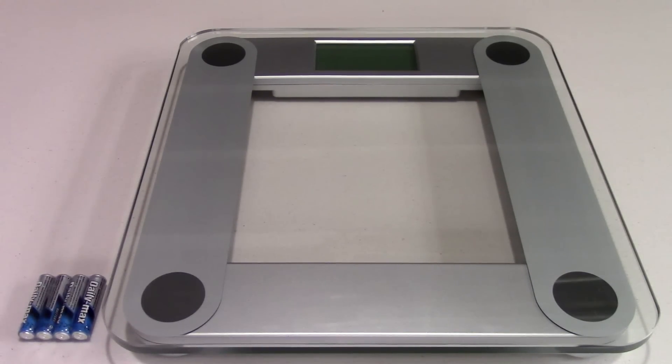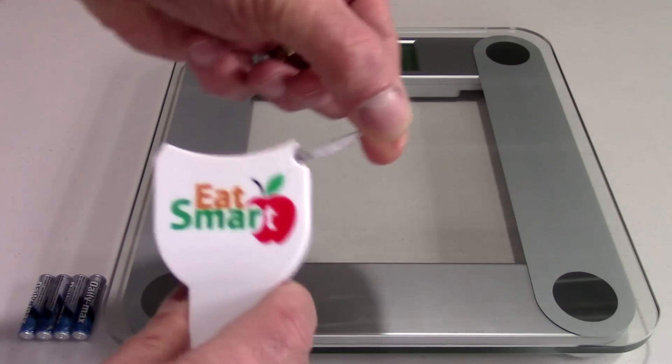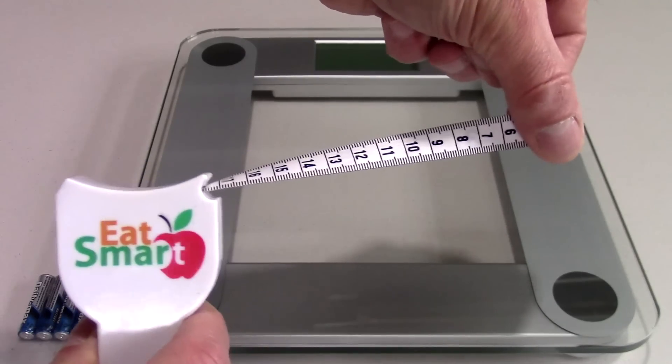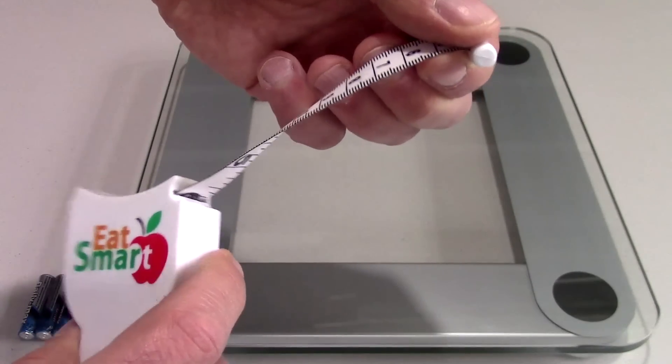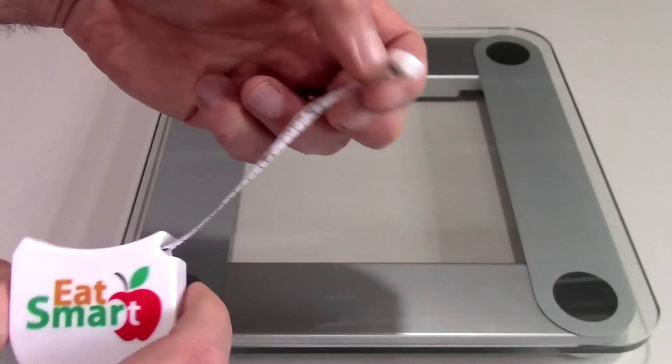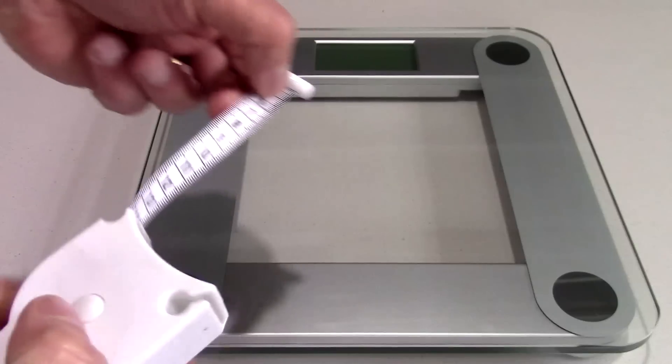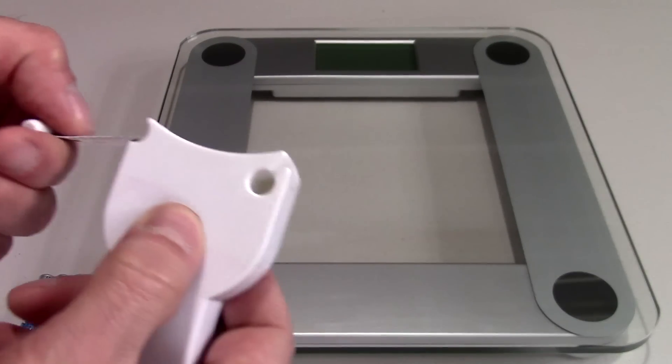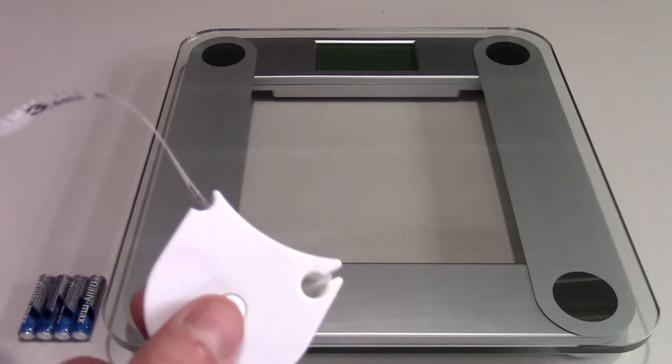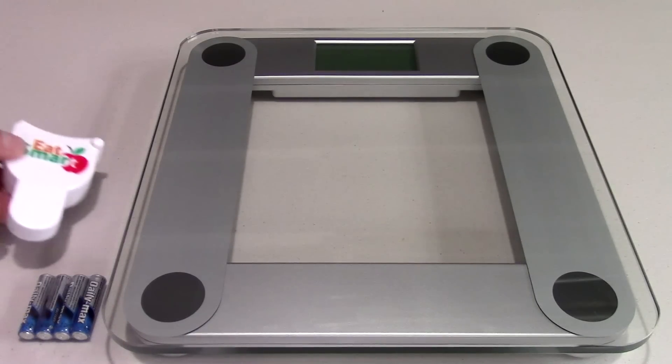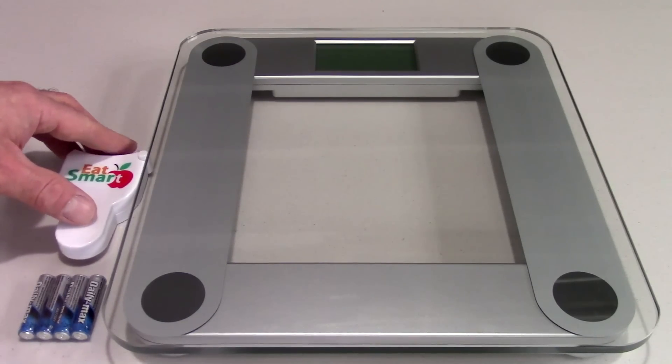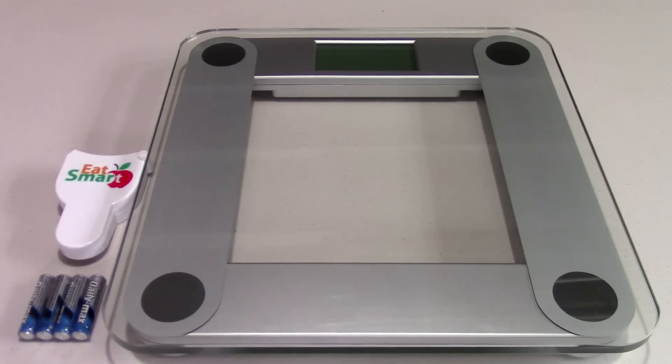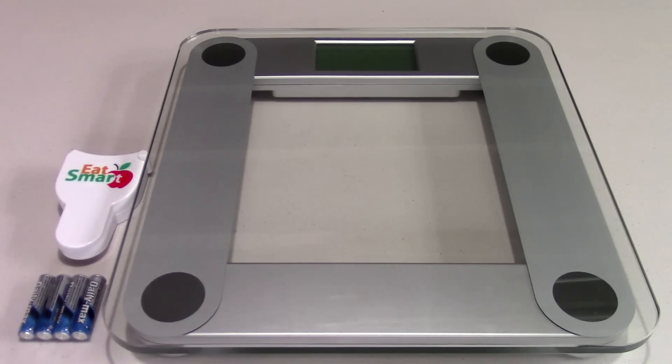Also you get this nifty tape measure. So you can go ahead and measure yourself, and it's got a release button on back. It's a really nice package for somebody that's on a diet or just wants to monitor their weight.